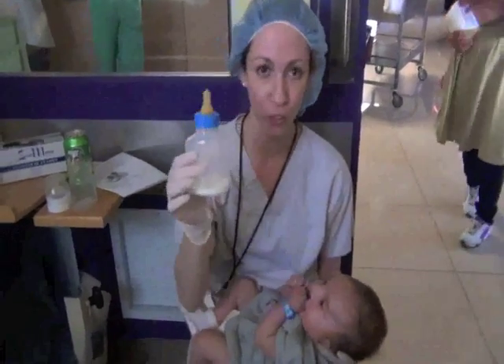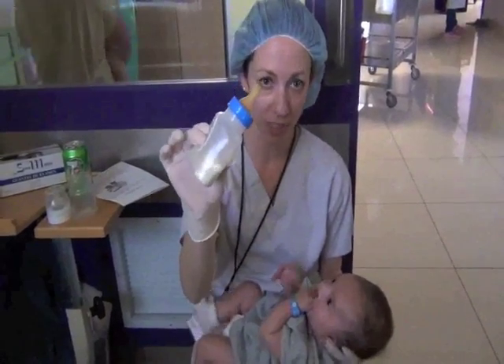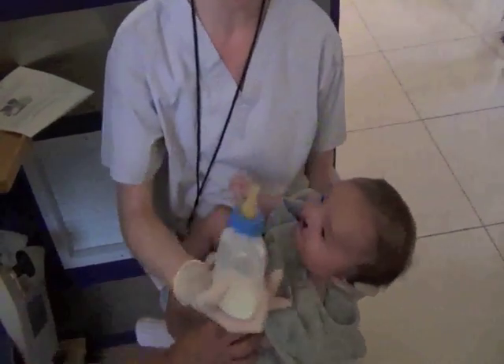This is a special bottle we use for children that have cleft palates. When using it, you want to apply a light force to the outside of the bottle, squeezing it. You want to place the nipple inside the child's mouth and you want to make sure that the child's at a good angle.